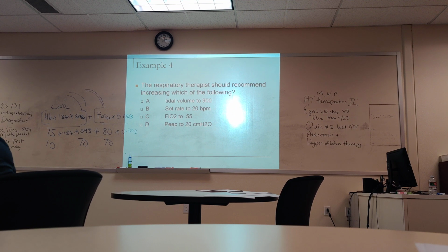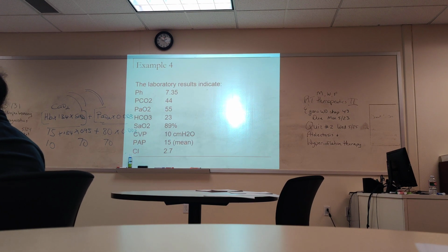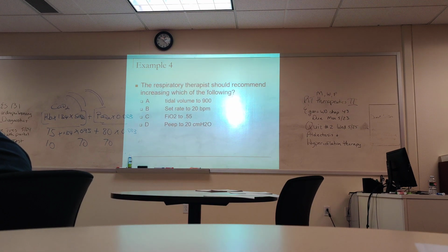Okay, like I said, now keep on increasing PEEP until you get the PaO2 that you want, or maybe you have a side effect. So we don't have any side effect here. Everything is good. And I'm not pleased with that PaO2, so I need to go ahead and add more PEEP.